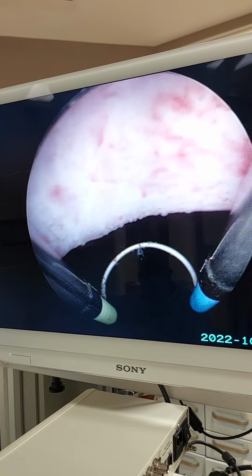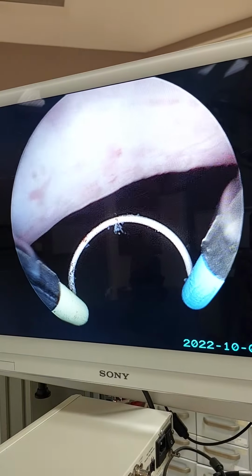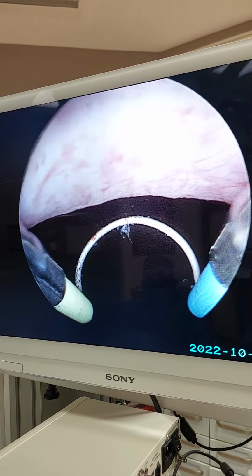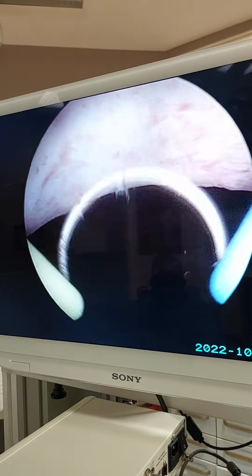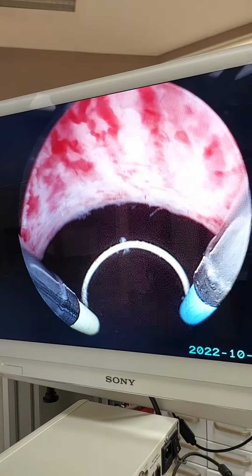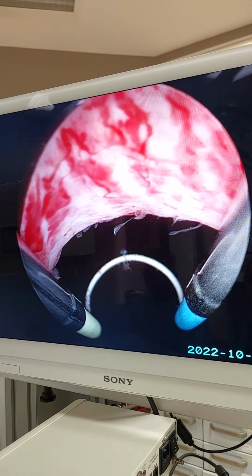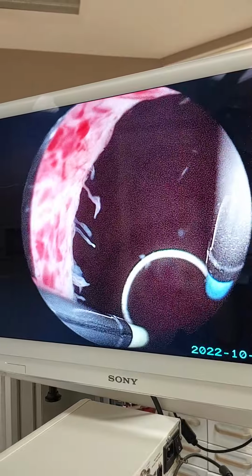Yeah, this is the top, upper part of the urethra, bladder neck. These parts are always missed, and infection usually is forgotten here. So I see little tiny polyps here. They are not so big, but still they are here. Look at these polyps.